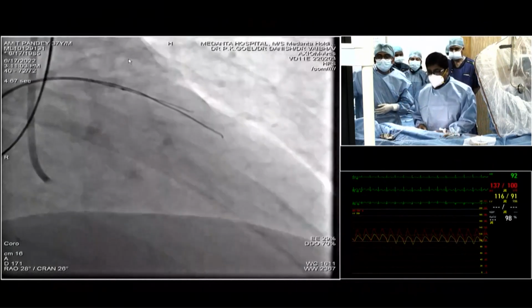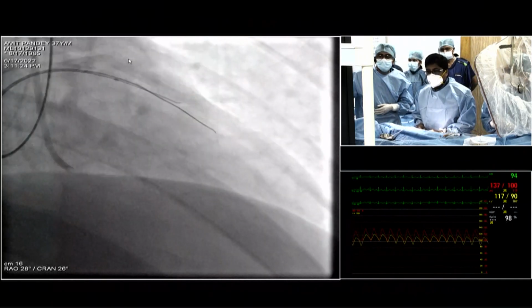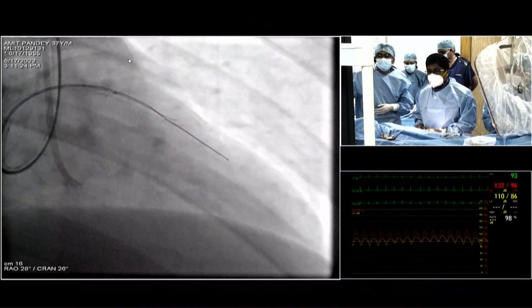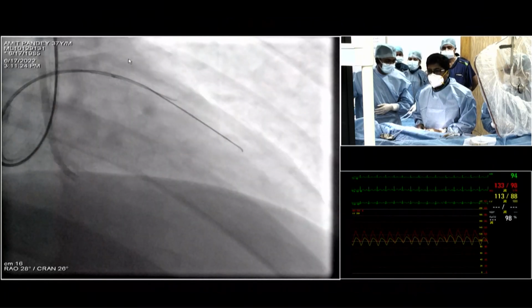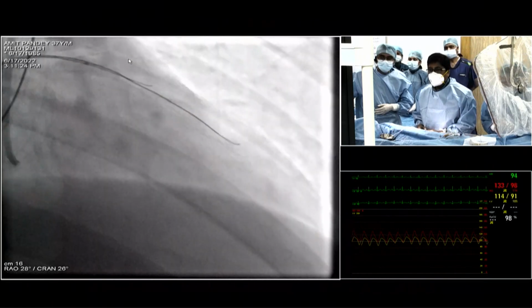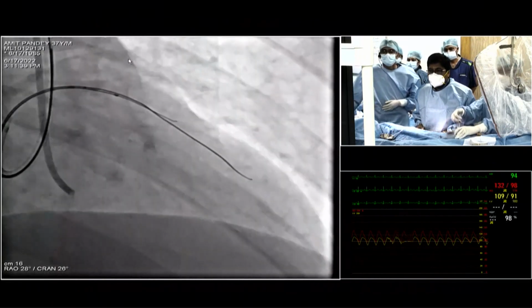How does the wire feel? If you are in the lumen, this should be a really low resistance event, right? I don't like how the tip of the wire is, but I can't feel it though. I see some haziness distal to the tip of the wire. But that imaging looks like it's moving pretty well. Right injection, please. No, you have to be cautious in pushing this wire.